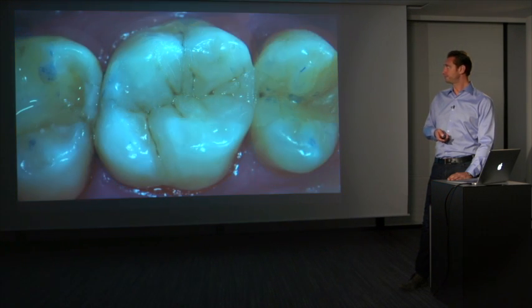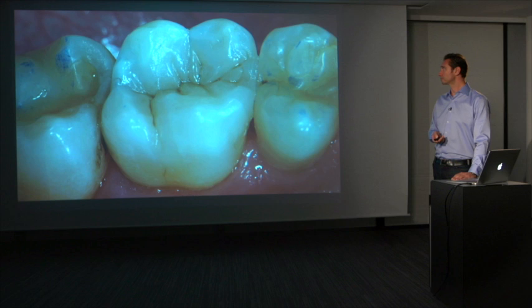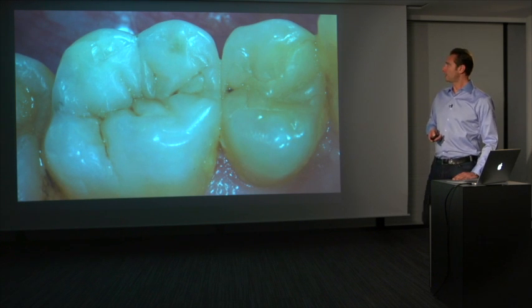This is the one immediately after removing the rubber dam and occlusal check, and final polishing after occlusal check. And this is the one at recall.